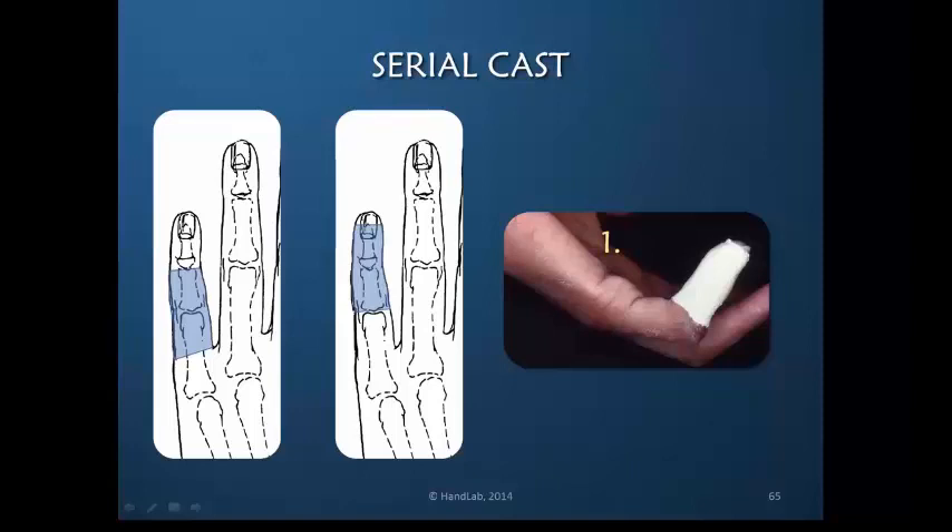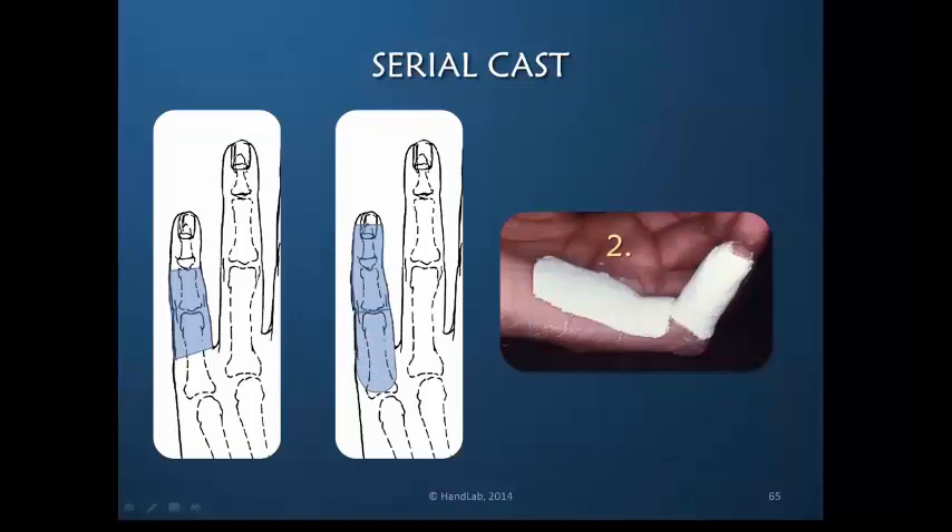...you will allow this to harden and the DIP joint will be immobilized. Next, a piece of plaster is added volarly that extends all the way to the metacarpophalangeal joint — this one is actually a little beyond. That volar tongue is relatively flat and relatively weak, so I would roll a small amount of wet plaster of Paris and place it there for reinforcement.